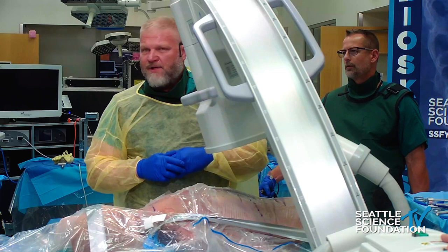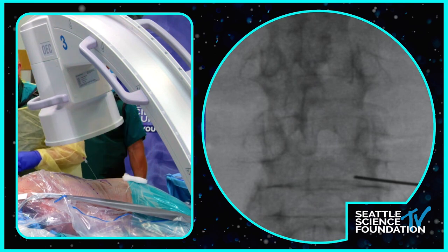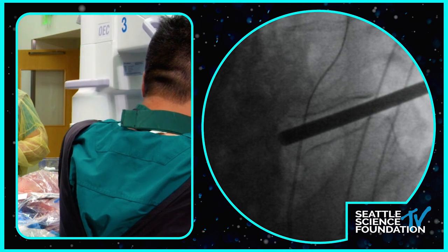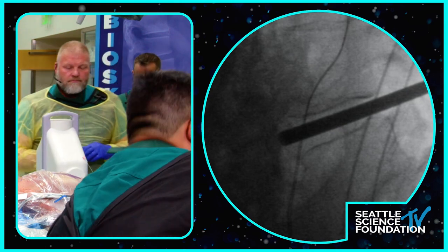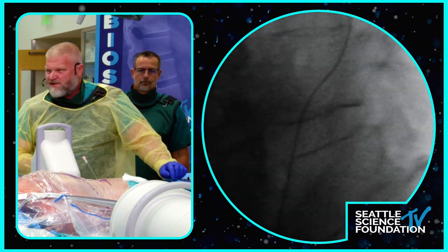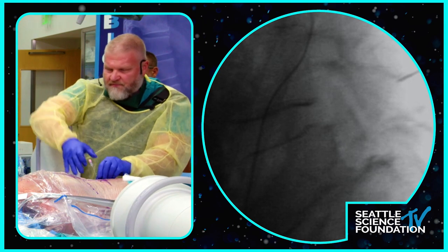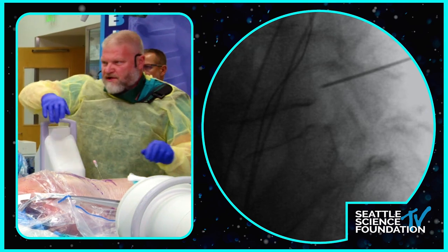So give me a shot there under AP. And I need to go more caudally. Shot there. So there I'm bumping into the facet, I believe. So we're going to go lateral. Now between the AP and lateral, I'll know where the tip of my needle is. And it looks like we're very dorsal. So I want to slip ventral to that. Shot there. Shot there. No.